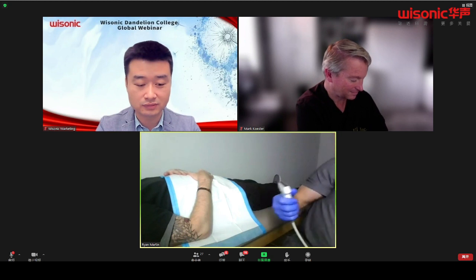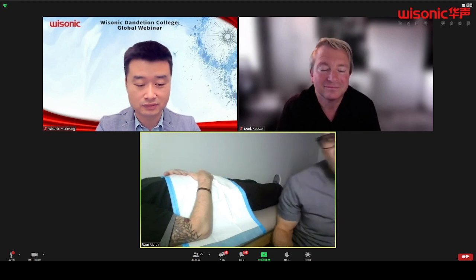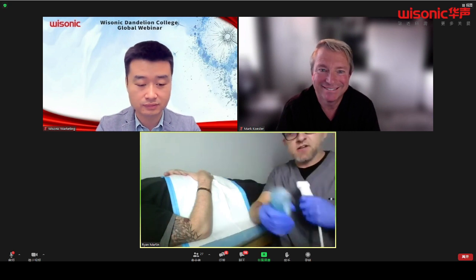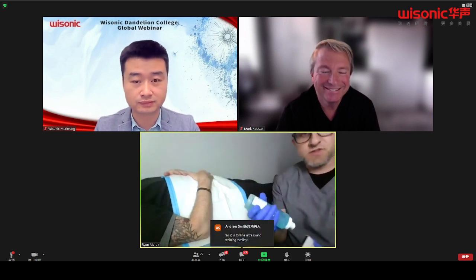All right. So the things you'll need. Number 1, you need an ultrasound machine. Ask Frank for one. Number 2, you need gel. Number 3, you need a patient. Let's start with those, okay?